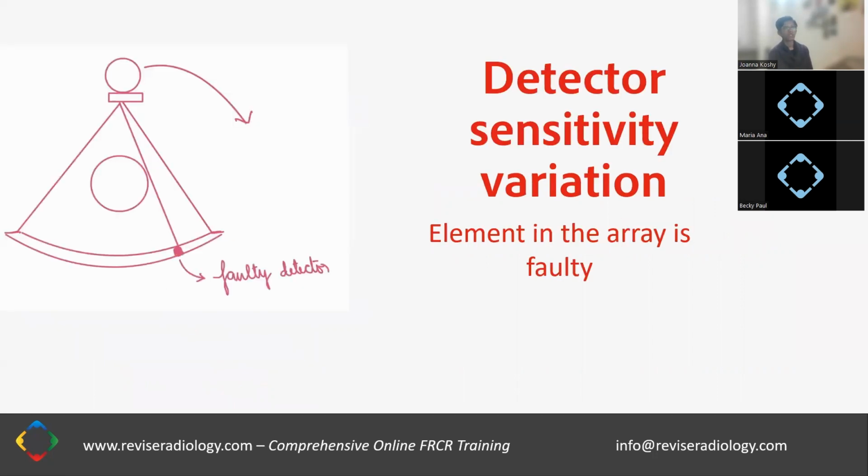So first, let's look at detector sensitivity variation. What happens here is that an element in the array is faulty, and you can see in the image there that in the detector array, there's one detector which is not working properly, which has been shaded in. So that is the faulty detector.